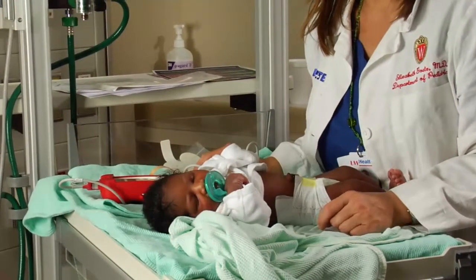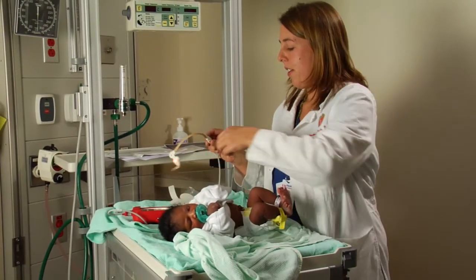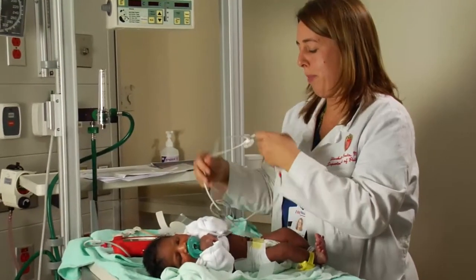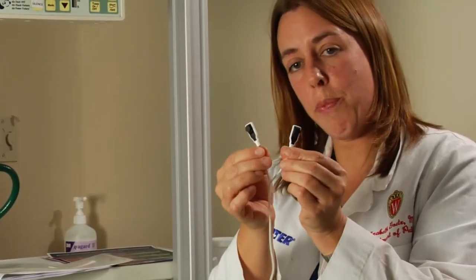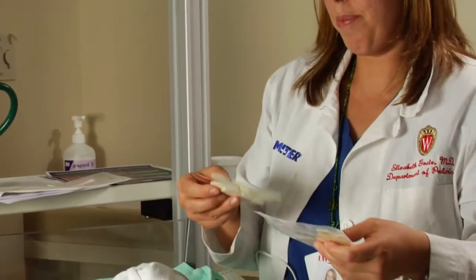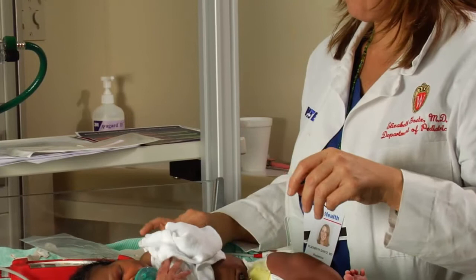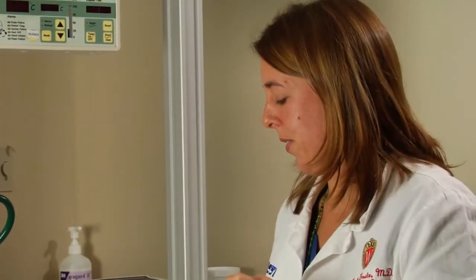After screening the baby's right hand, the next thing that you need to do is screen either one of the baby's feet. For this demonstration, I'm going to use the reusable oximeter, or the reusable probe, which many people will be using. This is a Y-shaped device with the two probes actually at the ends of the Y. There are 3 different types of probe covers that will come with the reusable probe. One of them is just a simple bar with holes in it, and I'll show you how to use those.